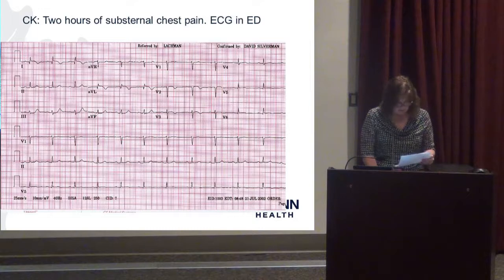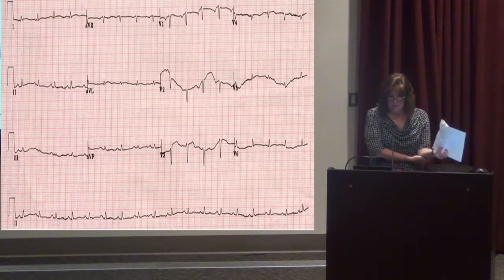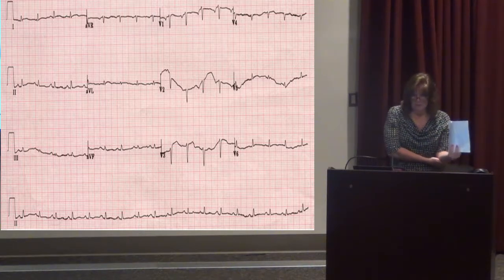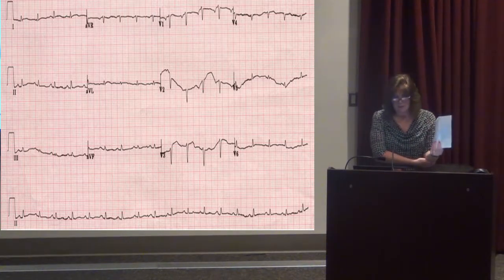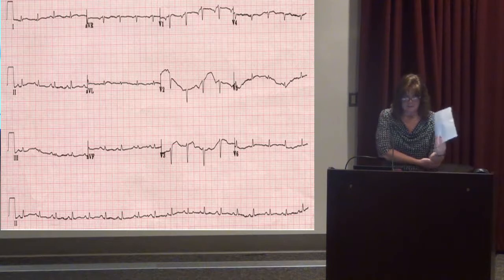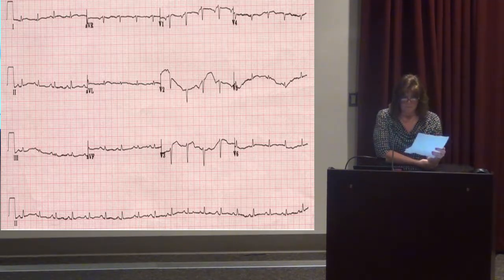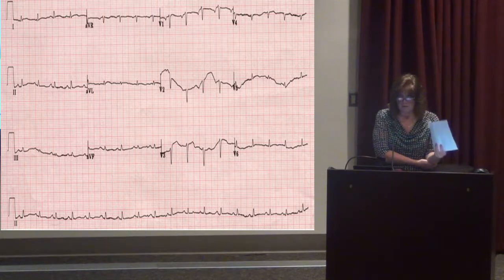Okay. All right, what about this one? So these are the type of EKGs you see in the ER that come in by ambulance. Don't you like the ones with the computer printed out so nice and neat? All right, so what do you think of this? Even though it's hard to see, you can still see if something's not right in lead V2, V3. What is that? ST elevation. What do we call that?